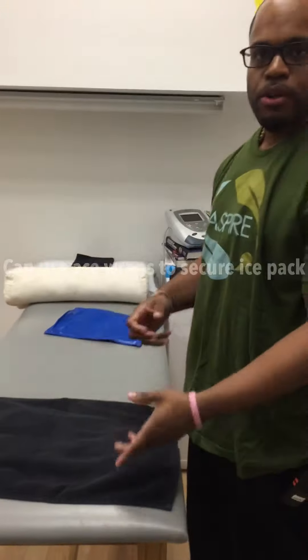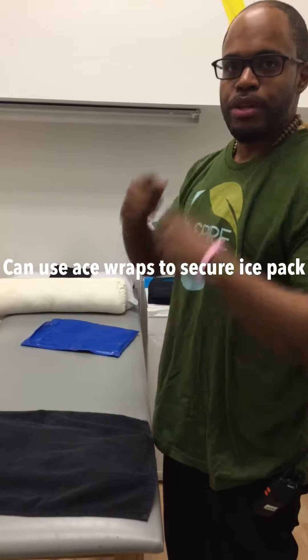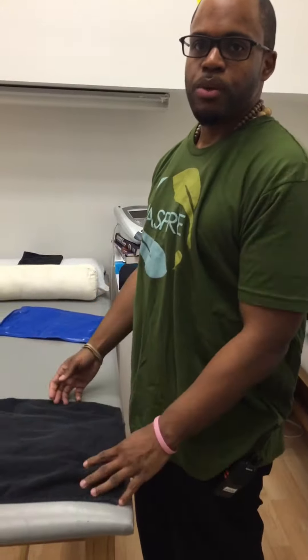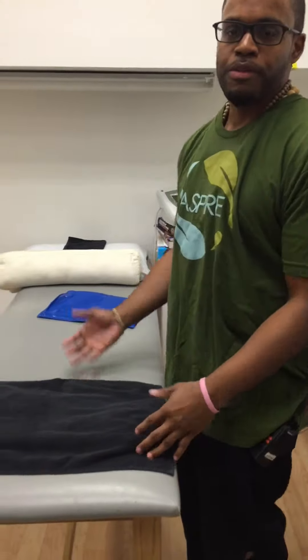We can use a strap also to keep the area secure, whether it's on the neck or the lower back or the knees, again depending on what the therapist wants to do. But that's the specificity.